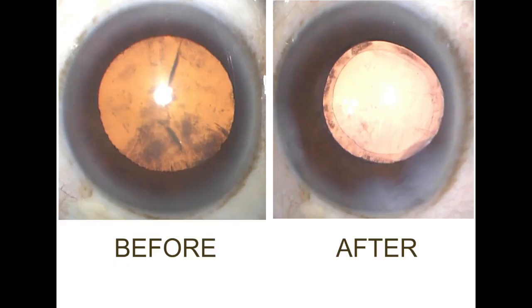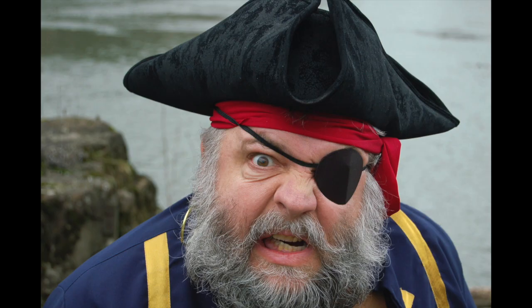Most patients notice an improvement in their vision immediately after surgery. As you can see from this picture, the cataract, which is kind of brownish yellow, is gone and now the lens is perfectly clear. Right after surgery, we put a patch over your eye — and yes, that kind of patch.